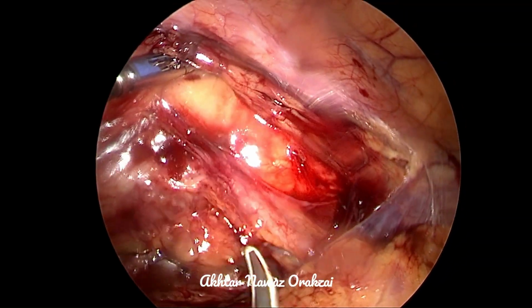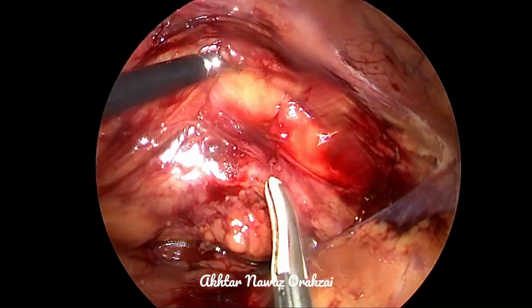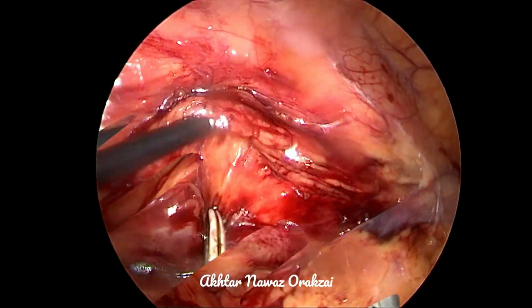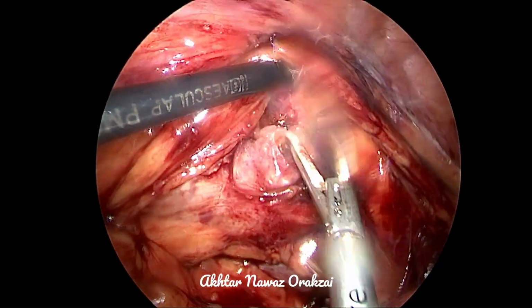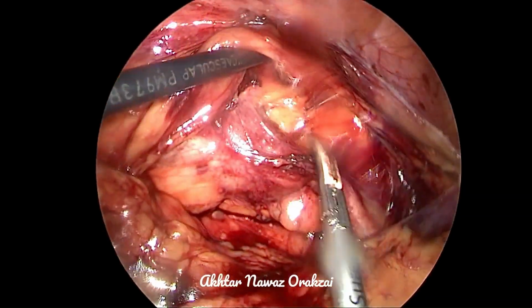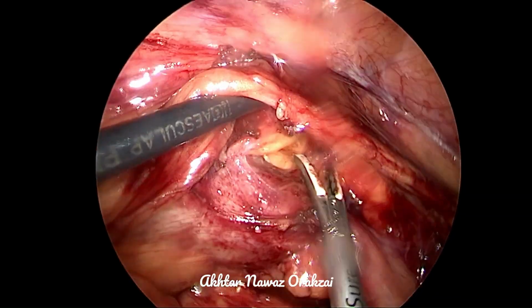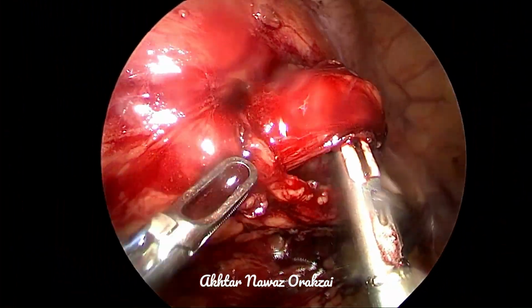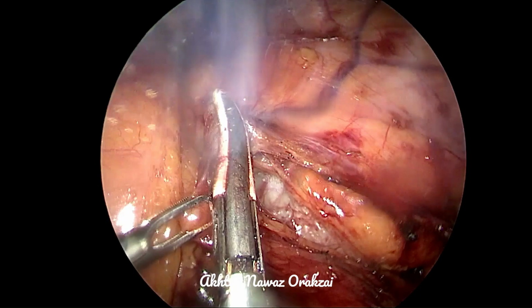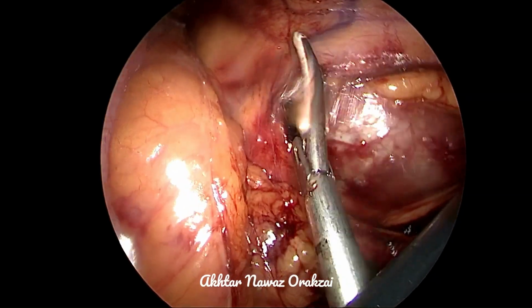Here you can see that we have dissected lateral to the gonadal vein, and we have identified the ureter. I'm using blunt dissection mostly, and not trying to denude the ureter. However, if there are bigger vessels, they need to be coagulated, and this is the area where the resection will be performed anyway. So we have now dissected the ureter, and this dissection of the tract continues above towards the pelvis.